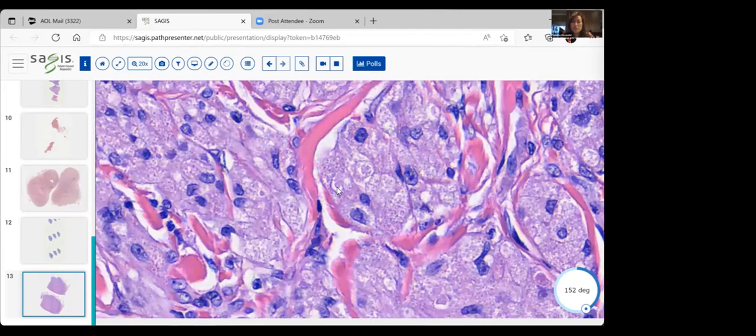And this has a special name. This is probably a phagolysosome, but it is called a pustulo-ovoid body of Milian. We love this. Pustulo-ovoid body of Milian, which are these little pink bodies found in the granular cytoplasm of these large cells of a granular tumor. So this is called a granular cell tumor.